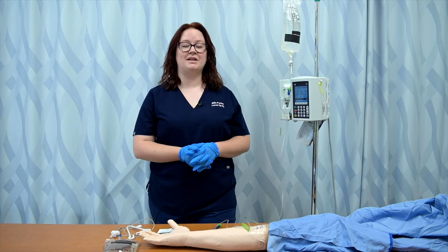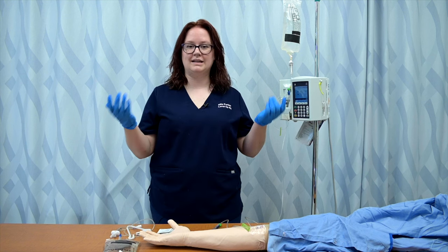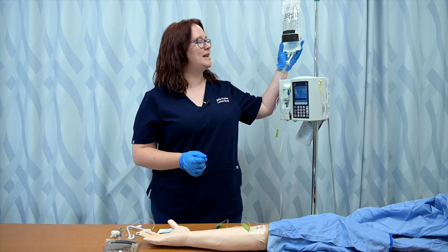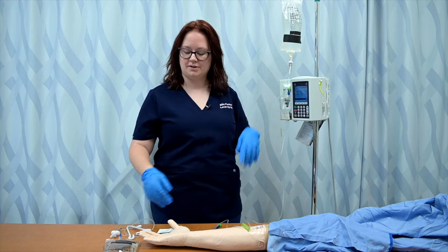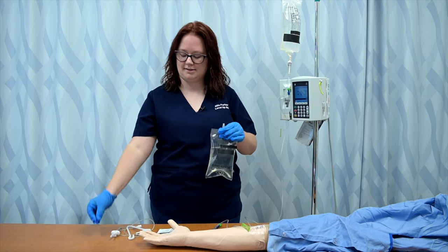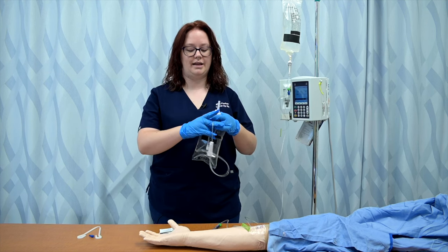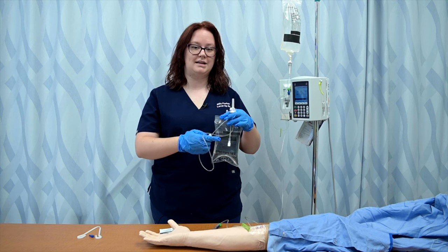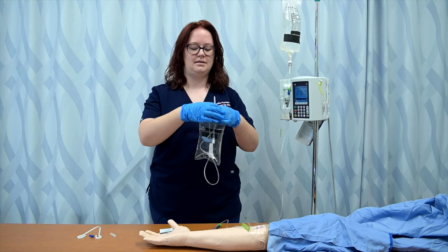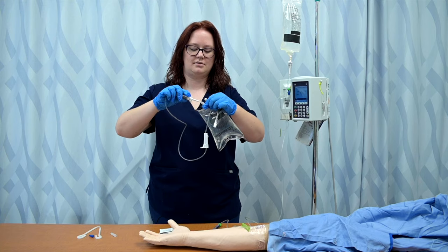To prepare for administering a secondary or piggyback, I'm going to have washed my hands and I've already got my gloves on. My patient already has a primary line set up and I've already noted that it's compatible because it is normal saline. That means it's okay to run my secondary line. So I'm going to get my bag and take the stopper out. I'm going to pick up my secondary tubing and make sure that it is clamped so that when I attach it to the bag, it doesn't immediately just run out. I'm going to take the cap off my spike end, and carefully push and twist the spike into the port.